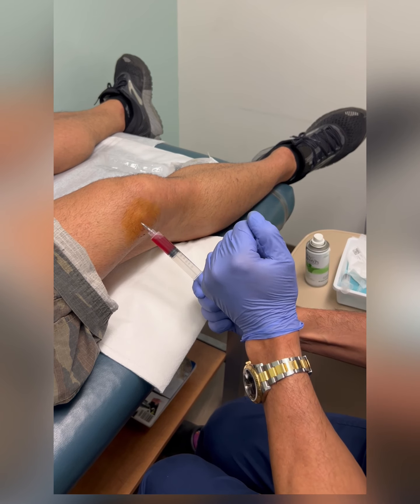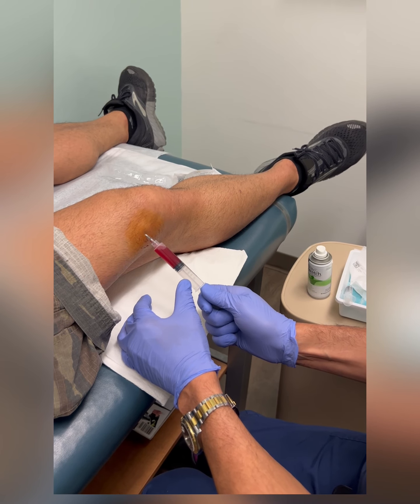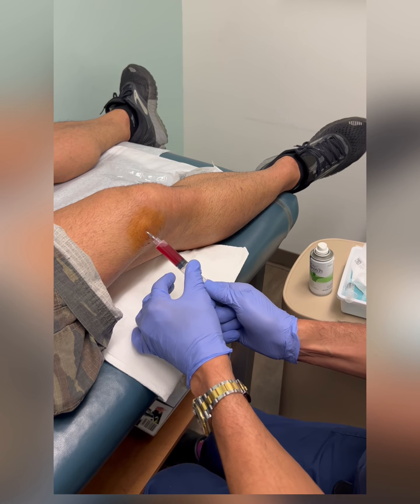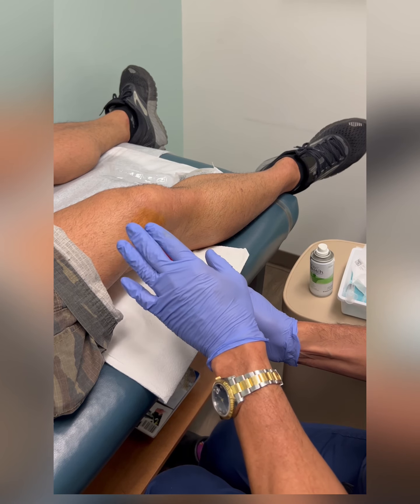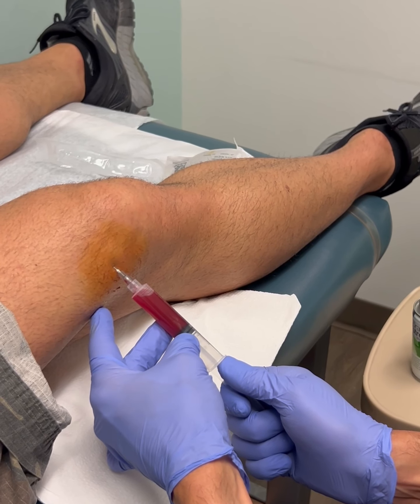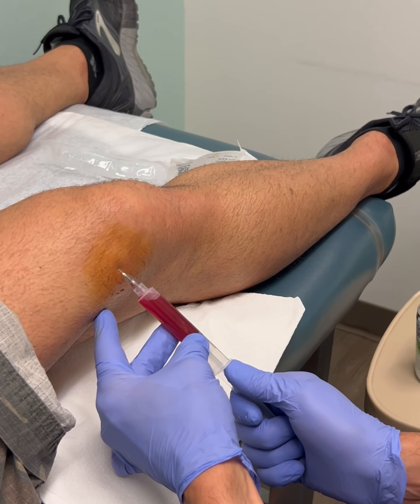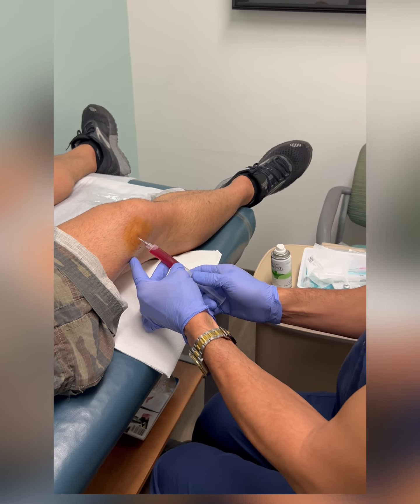I'm under the knee, under the patella at the superior pole — it's called the suprapatellar area. You want to do it right and without causing pain. The best thing to do is know your anatomy, numb things up nicely, and follow the technique I just showed you — there shouldn't really be a lot of pain.